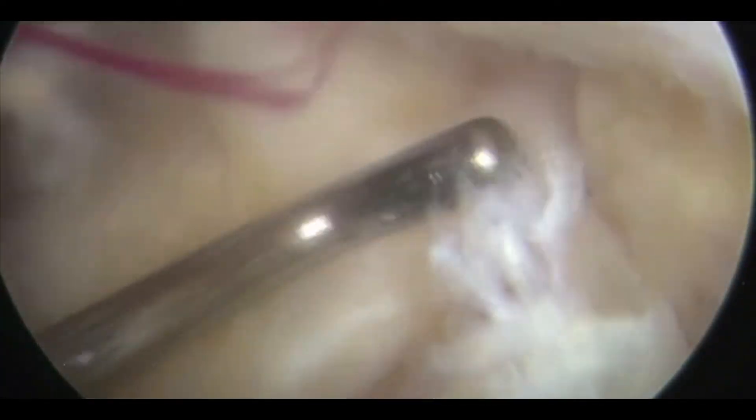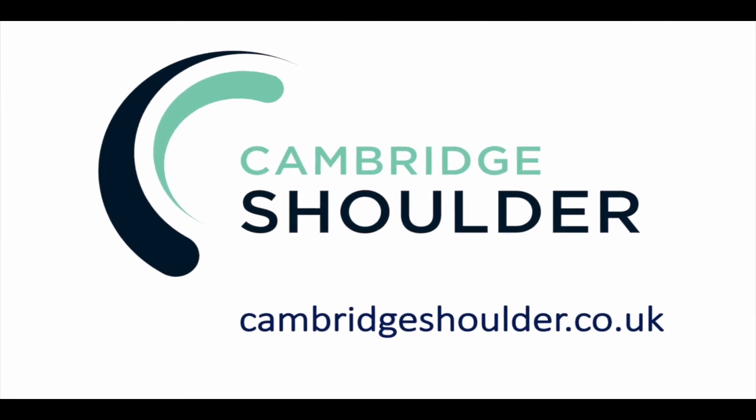You can see the tendon hasn't retracted, so we've got a nice tenodesis at good tension. You can just see the top part of the tendon which we're going to remove, and there's a little hole back into the joint — this is where the long-headed biceps was previously positioned.